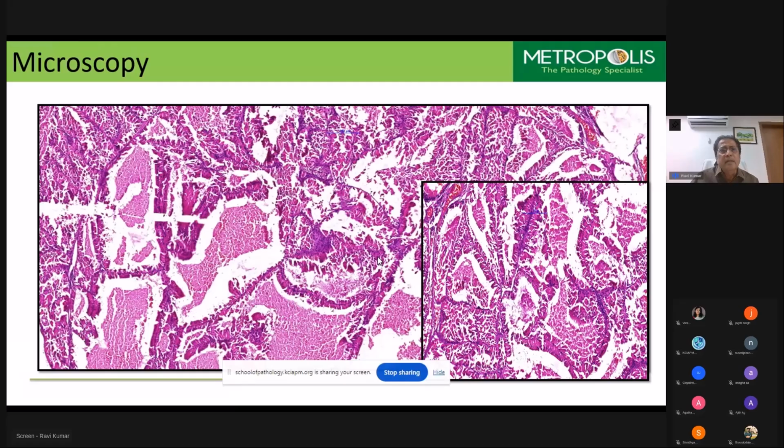Fine? As you can see here, as you described, most of them are stick-like lesions. They are almost, what are these? Can anybody describe how these things look? It looks like, for me, the Ane Patakesara. That is why you should always describe what is used by the other authors. We can also use our own things, what we do in Deepavali. We also use Ane Patakesara.